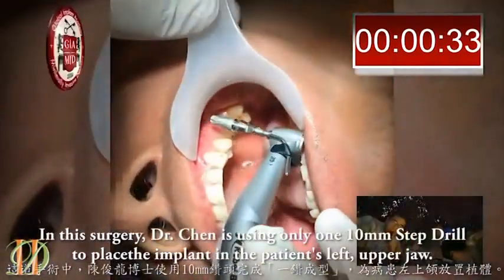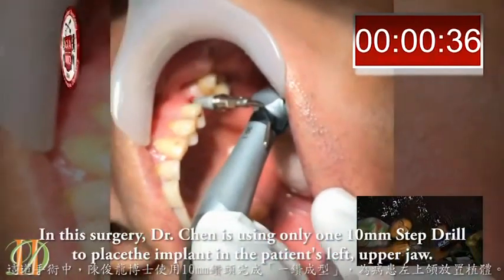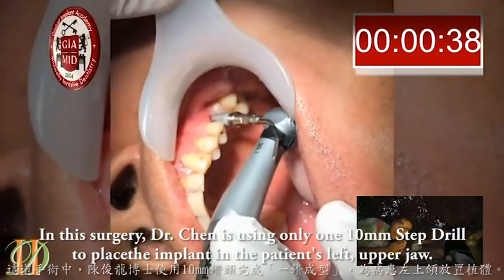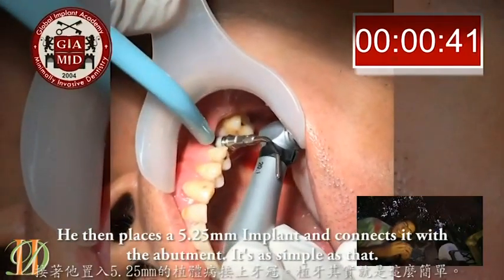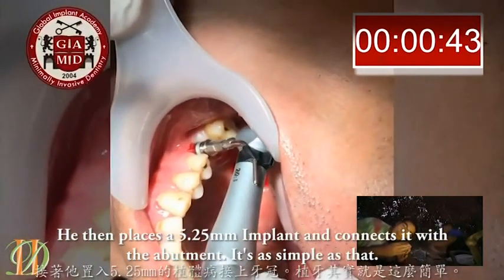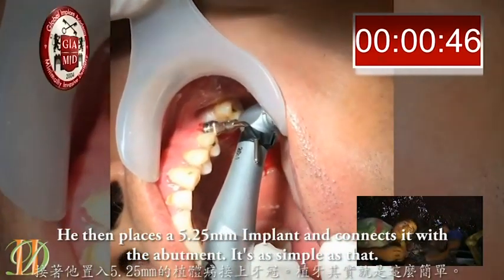In this surgery, Dr. Chen is using only a 10-millimeter step drill to place the implant in the patient's left upper jaw. He then places a 5.25-millimeter implant and connects it with the abutment. It's as simple as that.